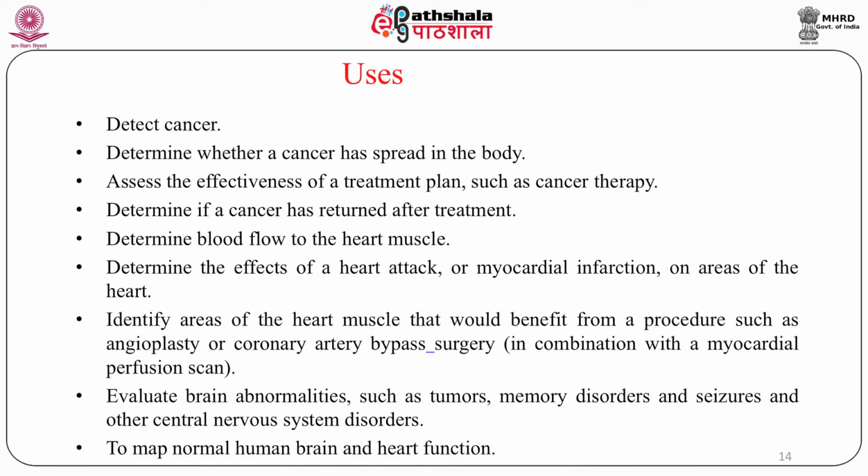Identify areas of heart muscle that would benefit from a procedure such as angioplasty or coronary artery bypass surgery in combination with a myocardial perfusion scan. Now, as I told you, it is very well known that cardiologists still say the gold standard is angiography. But if you really go through this particular technique, you are able to find out that it plays a very, very important role in coming to know without using invasive techniques.